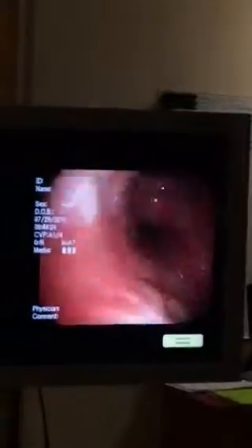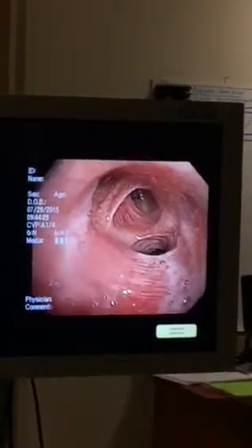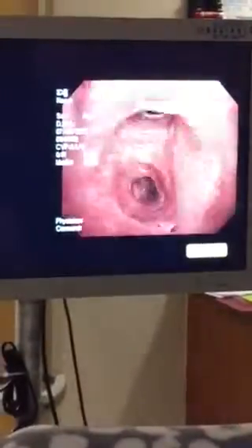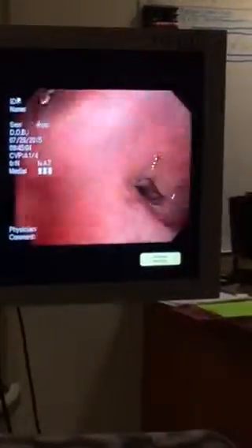All right. Okay, lidocaine left upper lobe, please. Ready for a blood? Yeah, lidocaine. Lidocaine. Get her numbed up, and I'm going to clear out some of the secretions, and then we'll get down to the lavage. The other area that's bad is the middle part of the left lower lobe. Now we have the left upper lobe. Superior segment, left lower, and then here's the basal segment. Those areas are really damaged.